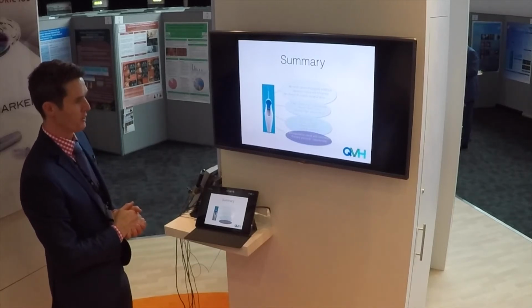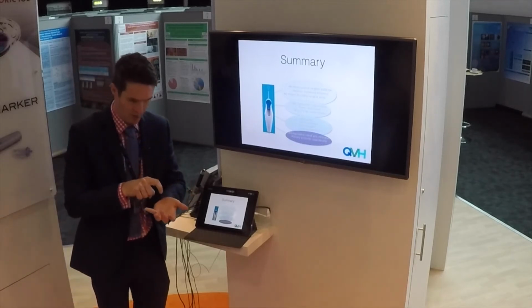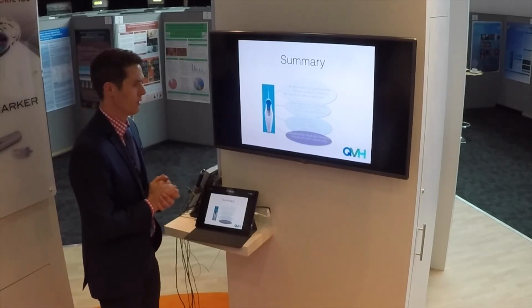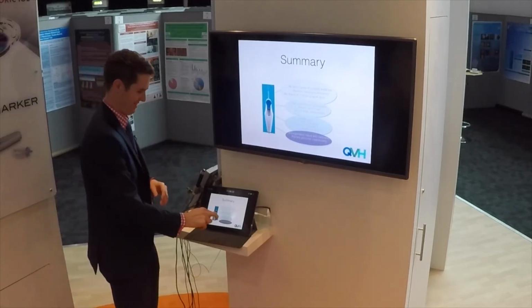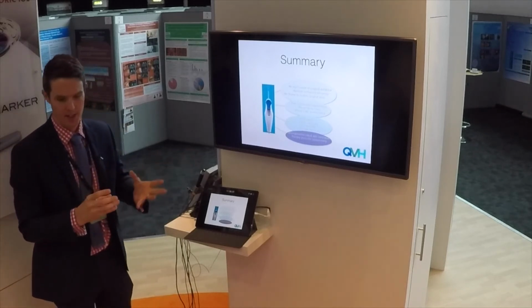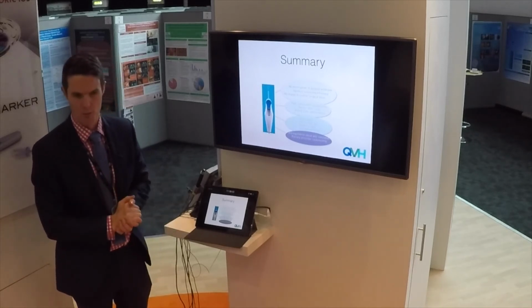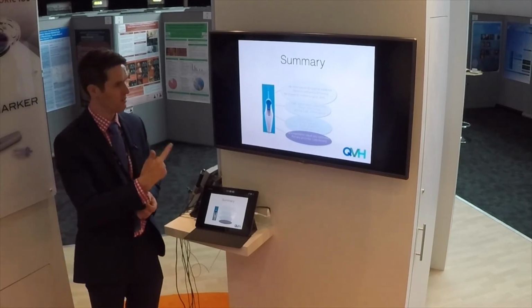You can get it on the visual axis, as I showed in the videos. Once you get more confident with it, you can get the center of the circle on your Purkinje images, and you get a nice centration to the opening each time. There's also a primary posterior capsulotomy under development. I'm not sure that I would do that. So in summary, I would say it's simple to use, repeatable and safe, and I think it's got good potential for use above and beyond both manual capsulorhexis and femtosecond laser.